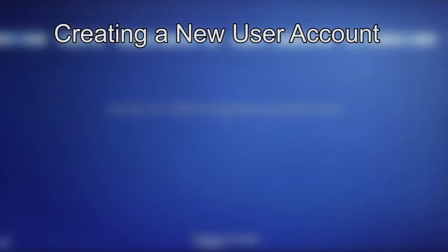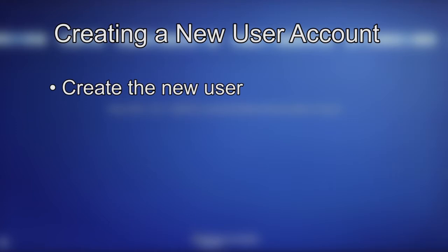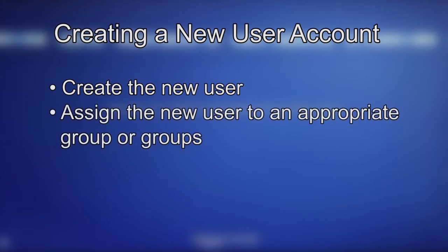Creating a new user account. As mentioned previously, user security is managed by Windows, so creating a user account in Windows gives access to the Windows operating system and the Vitek 2 system software. In order to create a new user account: first, create the new user, and second, assign the new user to an appropriate group or groups. Assigning a new user to a group or groups determines the privileges or functions that user can perform.